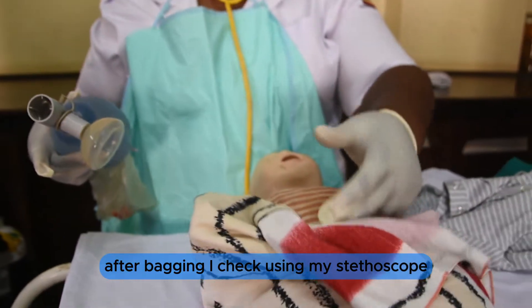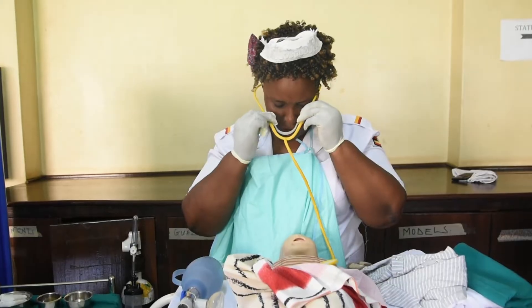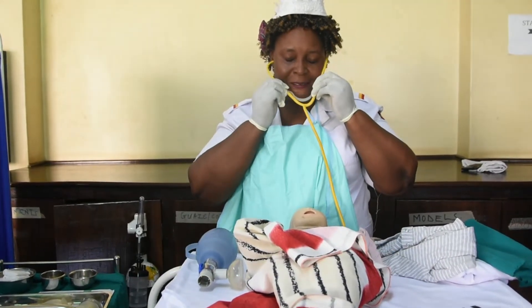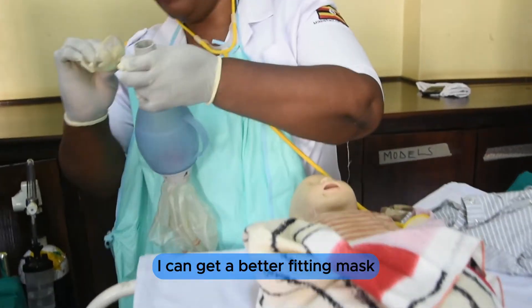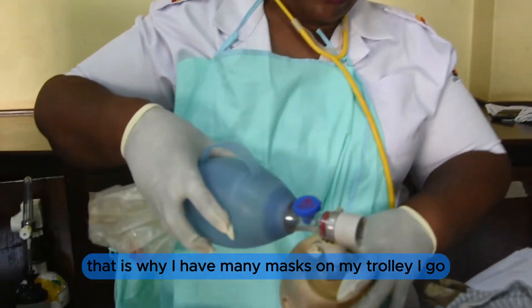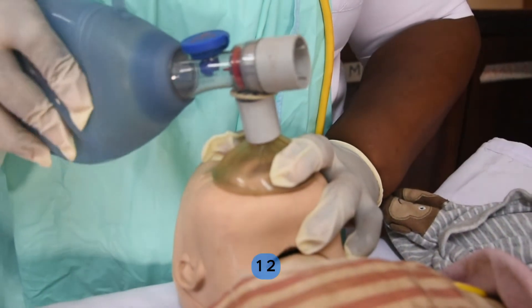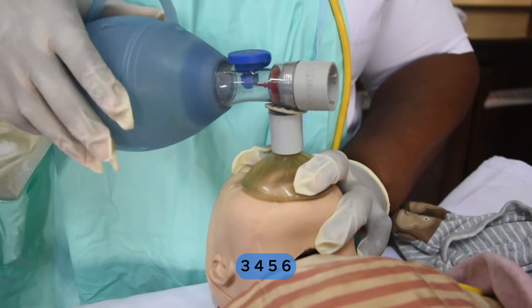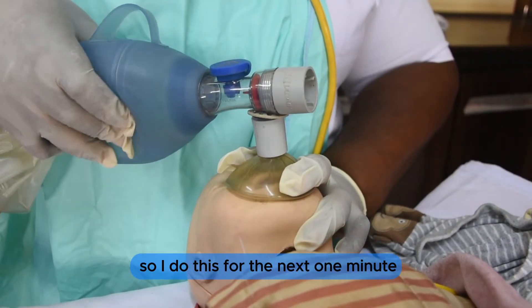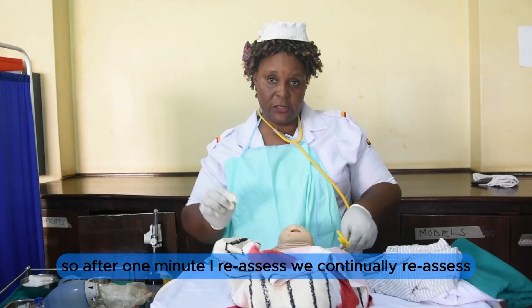After bagging, I check using my stethoscope for heartbeats. Heartbeat is still there but the baby is not breathing. I go again — that is why I have many masks on my trolley, to get a better-fitting mask. I bag again for the next one minute, then after one minute I reassess. We continually reassess.